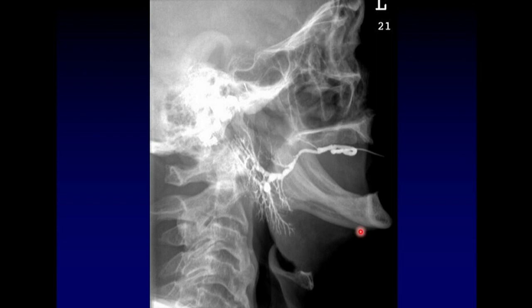Here is an example of an abnormal parotid sialogram. Notice here that the main Stensen's duct has areas of dilatation and stenosis — we call this beading, or a string of pearls appearance. Notice that some of the daughter branches within the gland are larger than their parent. These are the signs of chronic inflammation.